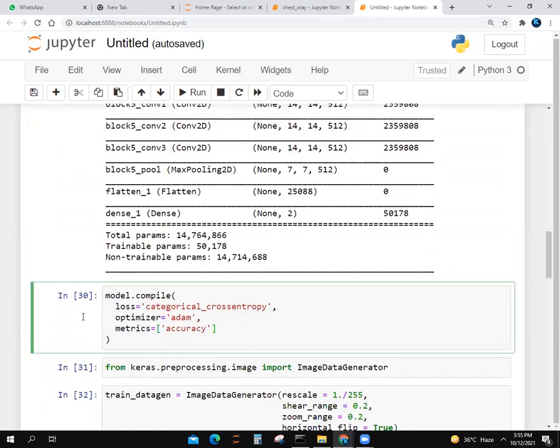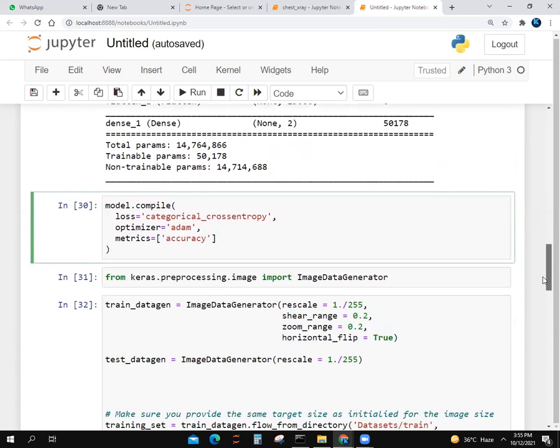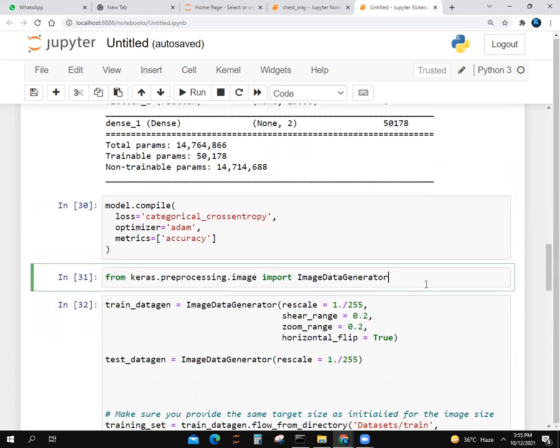We make a variable of model. We put model inputs as VGG.input and outputs as prediction. We compile our model by model.compile. Our loss was categorical crossentropy, our optimizer was Adam, and our metric was accuracy.